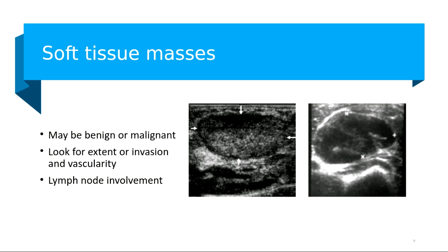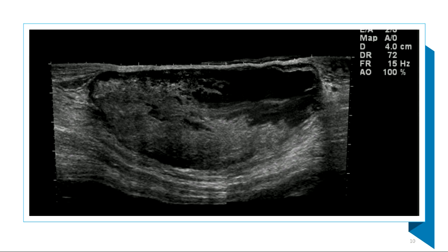Soft tissue masses are more common than you might believe and may be benign or malignant. Your role is to determine the extent of the mass, its size, its vascularity, and whether there's lymph node involvement. Here's a large sarcoma embedded in the muscle fibers — you can see the fascia linings and surrounding muscle. You'll measure it, note its location, and apply color Doppler to assess the extent of flow.